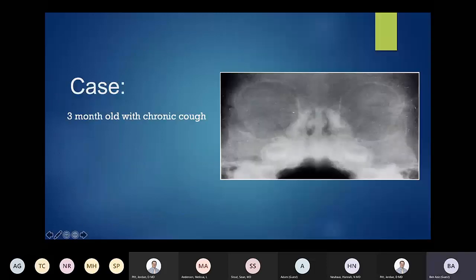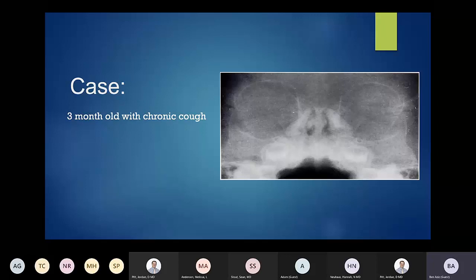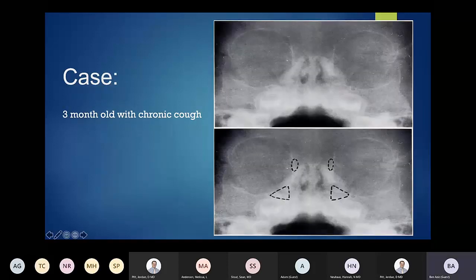Case: a three-month-old with chronic cough. At about three months, the maxillary and ethmoid sinuses should be fairly well developed and visible on radiograph. As we can see here, there is pretty much complete opacification of the bilateral maxillary sinuses. With lines drawn showing where the maxillary and ethmoid sinuses are, you can see some opacification of the ethmoid sinuses up here, and clearly there is opacification of the maxillary sinuses.